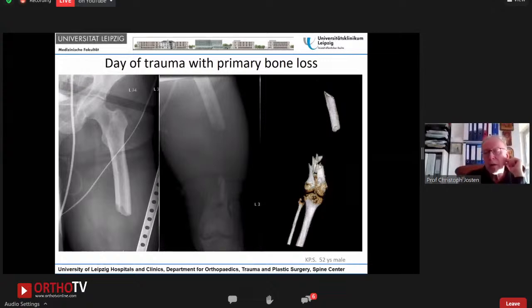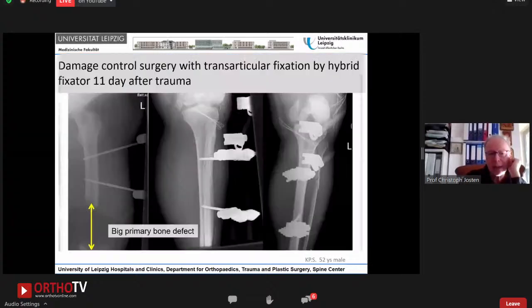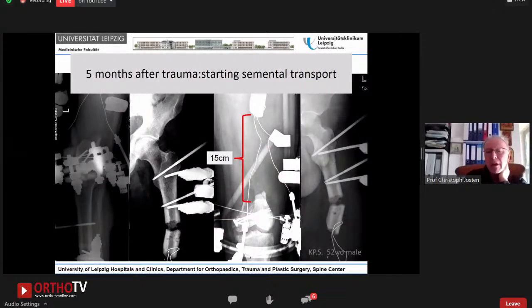This is a male, 52 years old, with an accident, a traffic accident, with a very big primary bone defect and a C3 type fracture here. And of course, the primary stabilization is transarticular fixation by a hybrid fixator. And after 5 months, we have to do a lot of soft tissue reconstruction. We started with a segmental transport that was a defect of about 15 centimeter.